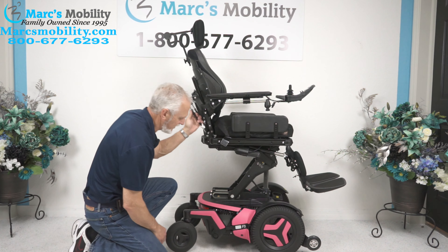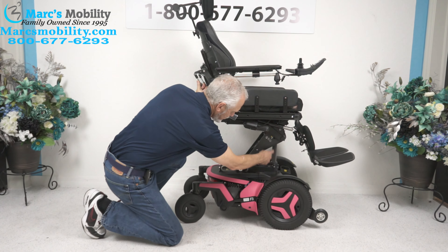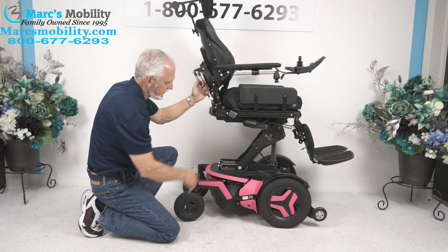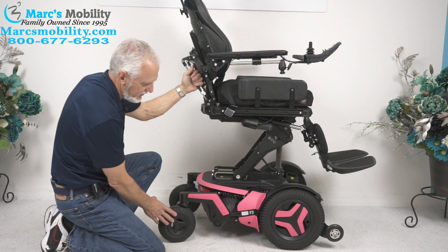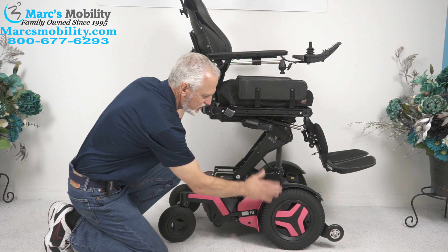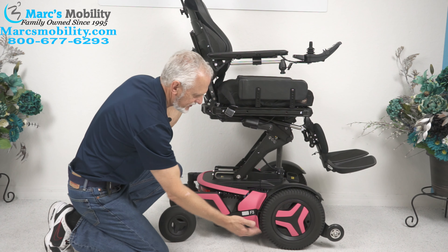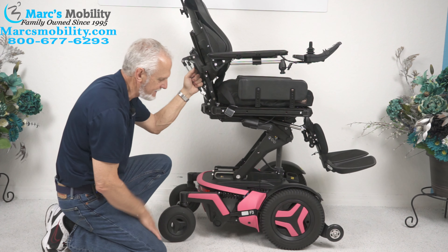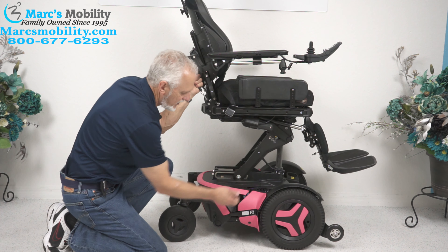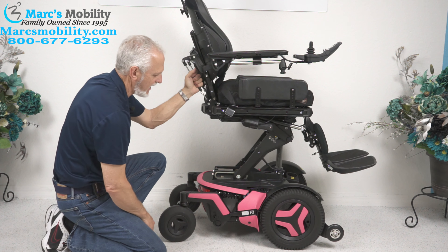Let's look at the base. You can see the seat actuator right here — you can see how well constructed and solid that is. We've got an eight-inch caster wheel back here, a 14-inch non-skid wheel in the front, and a tip wheel that never touches the ground — that's for your protection in case you do something crazy. You have suspension for the front and suspension for the back, so you have two shocks on each side.